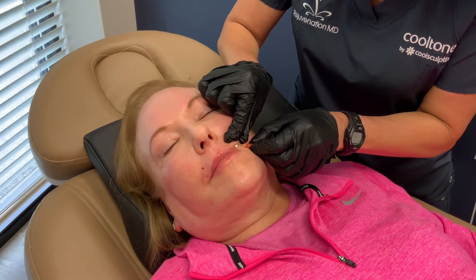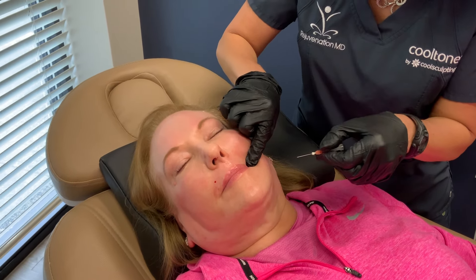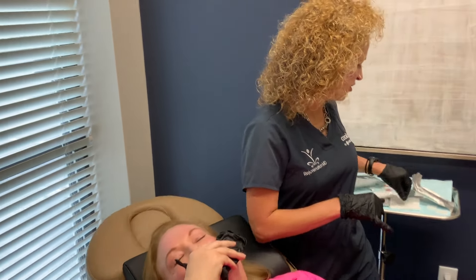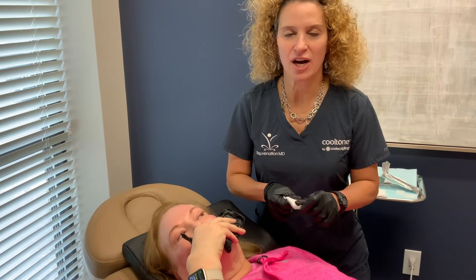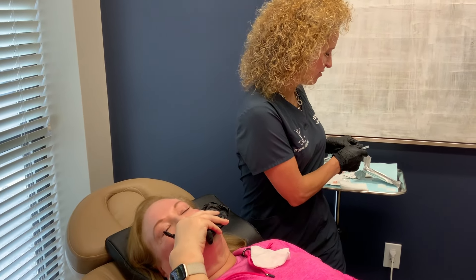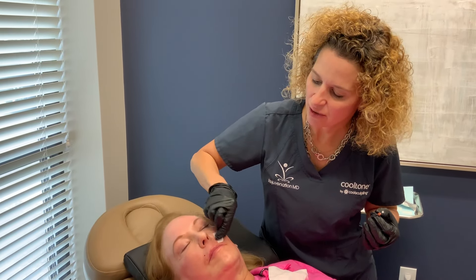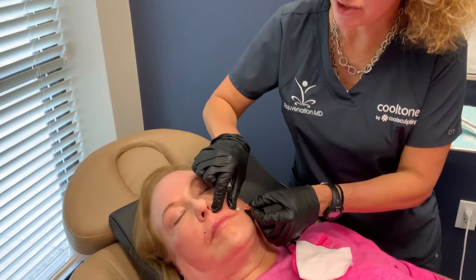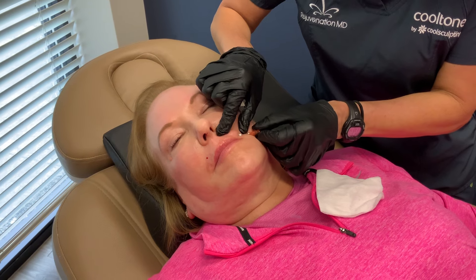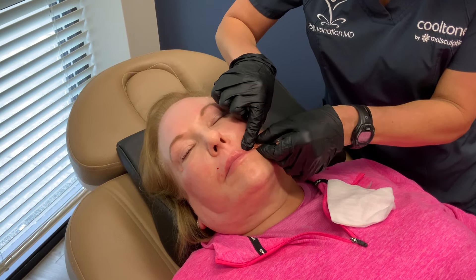There are all sorts of different types of PDO threads. These are the smooth ones. There are twisted ones that you could put in the lip or somewhere where you want to get volume. We'll use them a lot for nasolabial folds or marionettes if you want to add volume in addition to getting the lift. There are also ones that lift with barbs, and those are a little bit longer. Just make sure you go to a provider that knows the difference between the different types of threads and which ones go where — it really has to do with what your goals are.